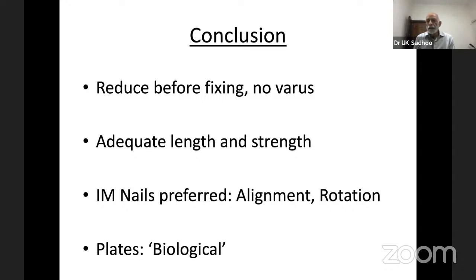Essentially, just turn the picture 90 degrees in your mind, so that there's no pigeon toe deformity, as it were. If the foot is internally rotated, that should raise your hackles before you put the distal screws.